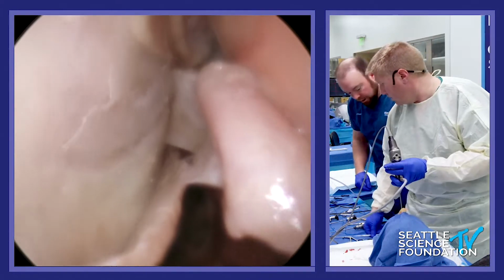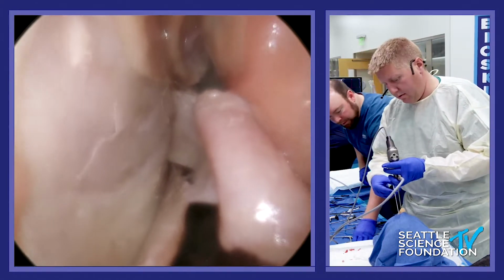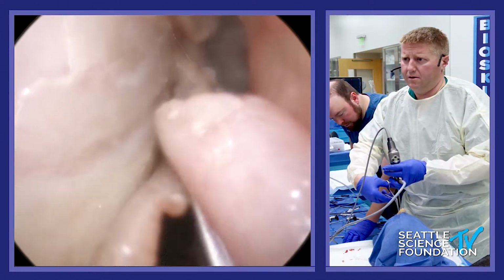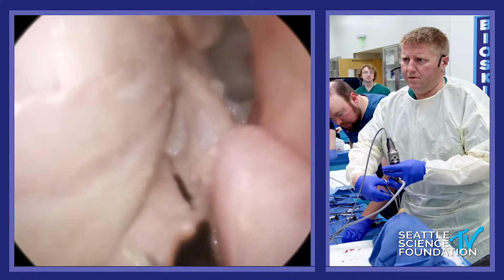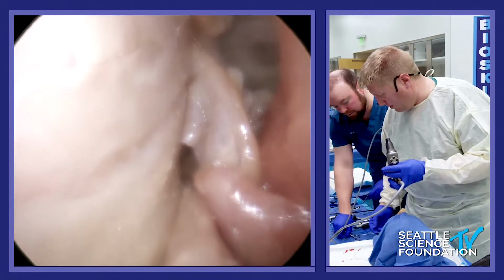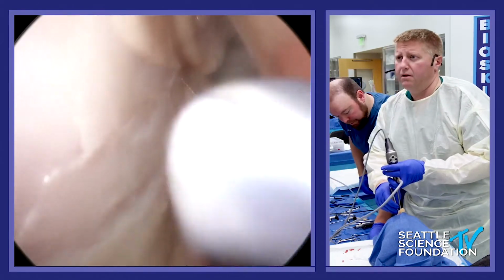Do we have any scissors? Or a through cutter? Okay, great. Okay, I'll take that Cottle back. Right there. There we go. Oops. Okay.